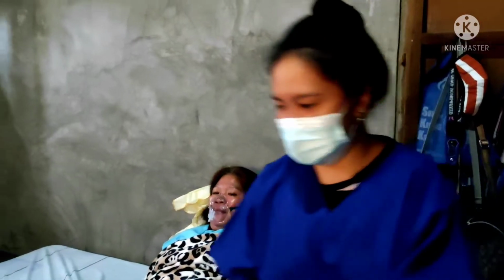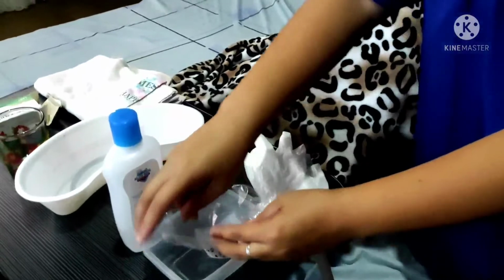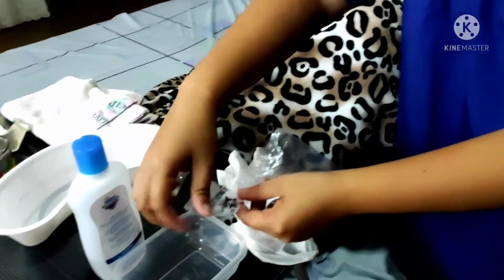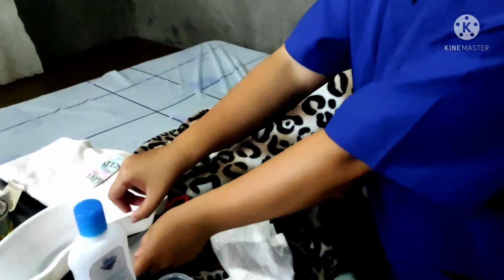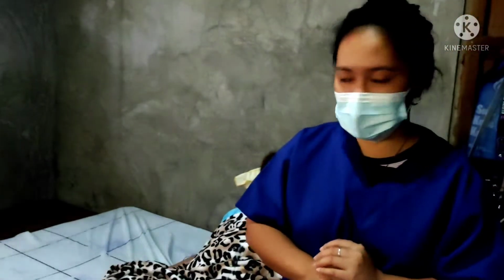Now prepare the suction catheter by opening the suction kit or catheter using aseptic technique. So let's assume that this is a suction kit, and this is a water-soluble lubricant. If a drape is available, place it across the patient's chest or on the overbed table.